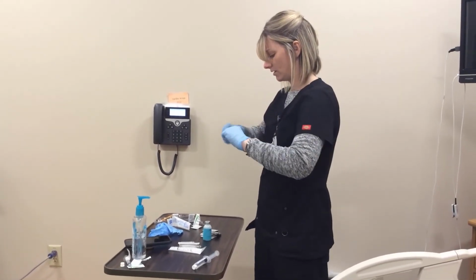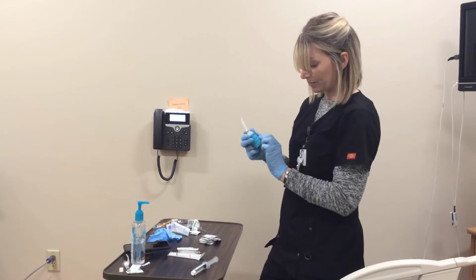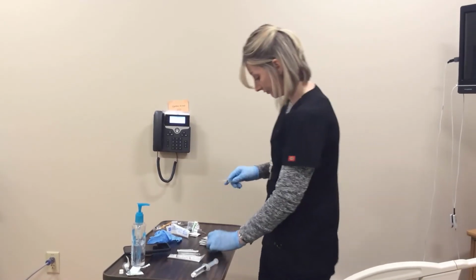So I'm going to go ahead, take a look at my vial here. 20 milligrams per ml. My order is for 40 milligrams, so I know by doing my math, I need to give 2 ml.